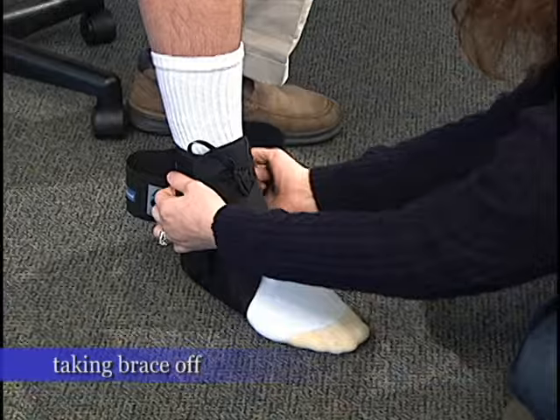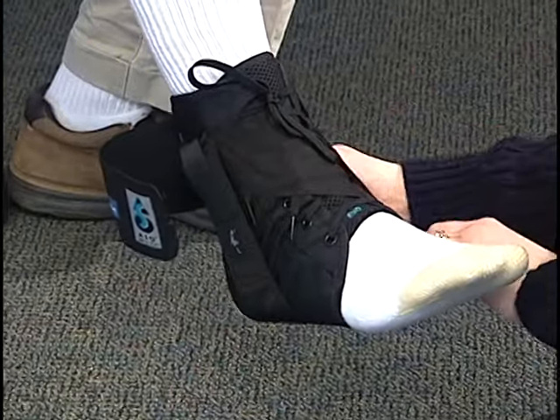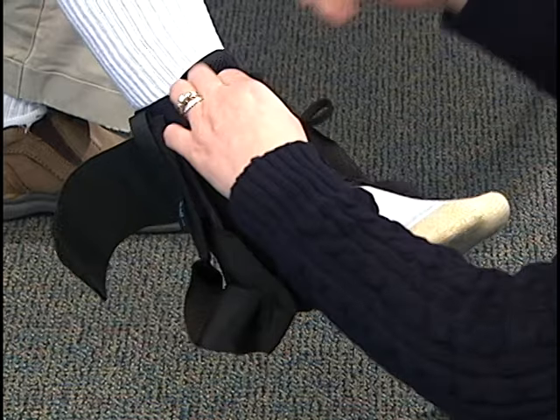Unvelcro the first strap, and the second strap, and attach it on the side. Third strap, attach it on the side, and unlace all the way down.